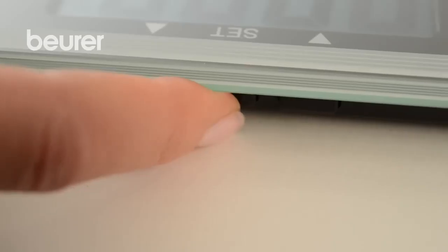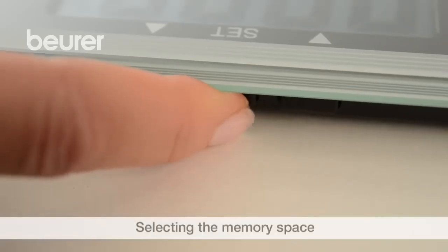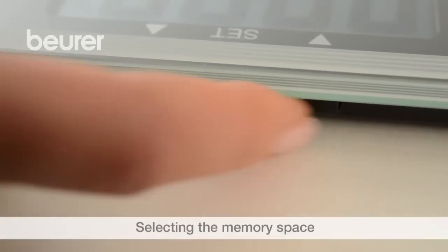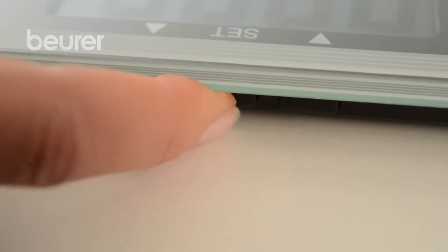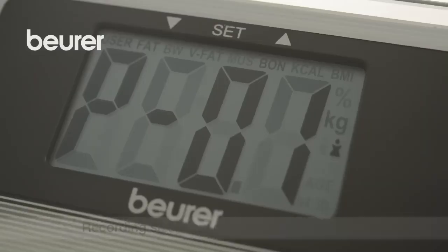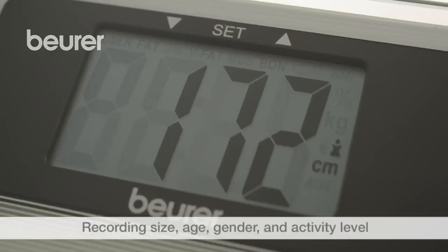Start by pressing the Set button. Then select a free memory space using the arrow buttons and press the Set button to confirm. Then proceed as described to specify size, age, gender, and activity level.